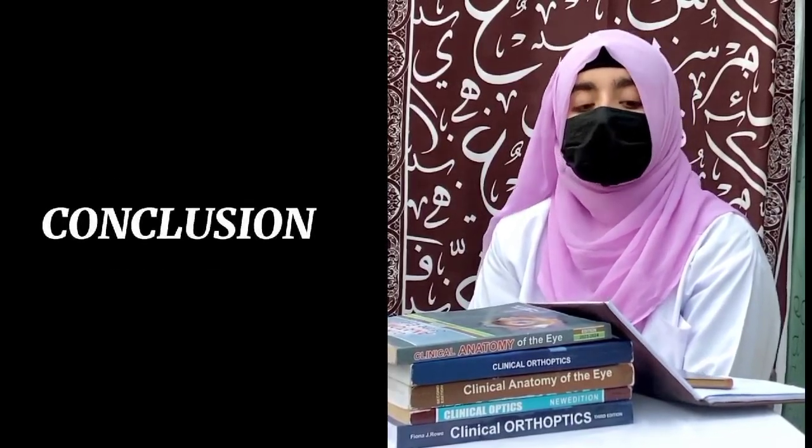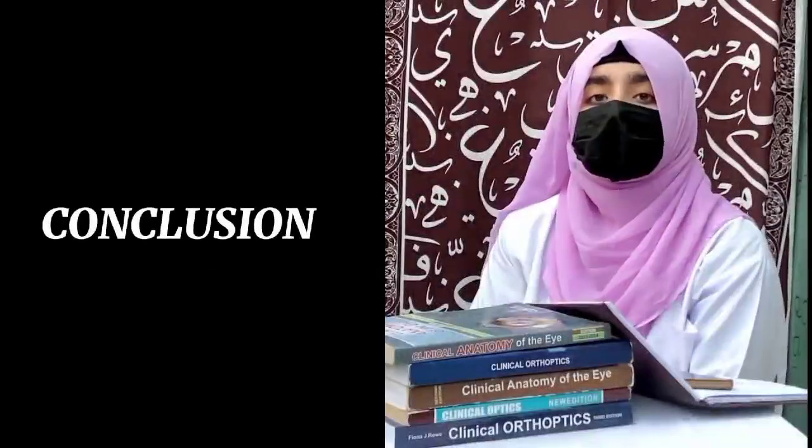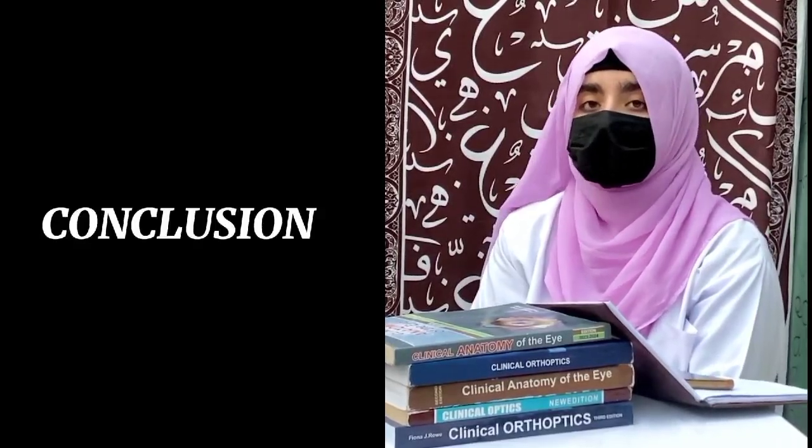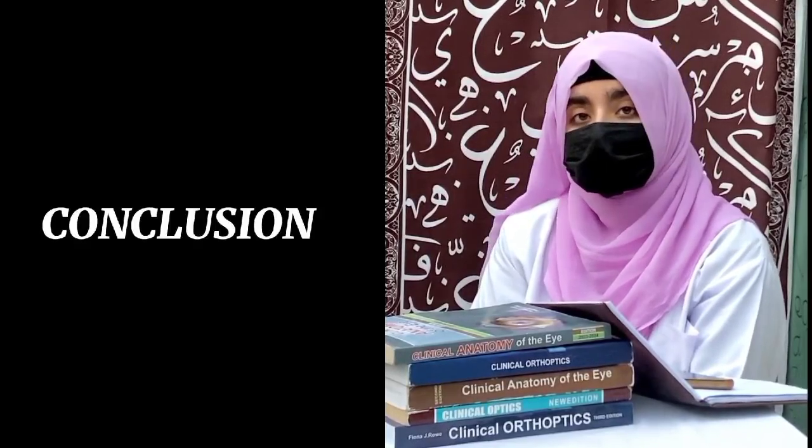You should do retinoscopy on every person you examine. It provides a starting point of refraction. It estimates refractive error in persons with difficulty in communication, like babies, the mentally unstable, and the deaf and dumb.